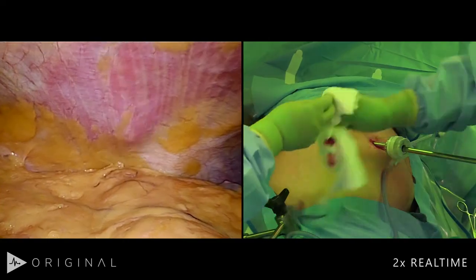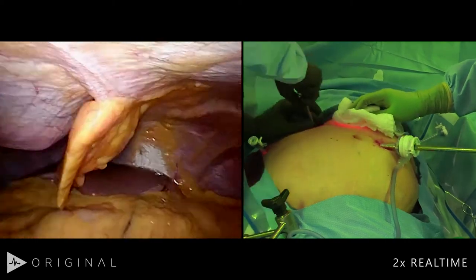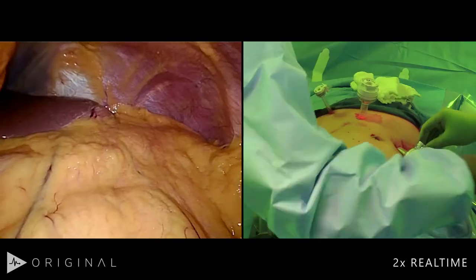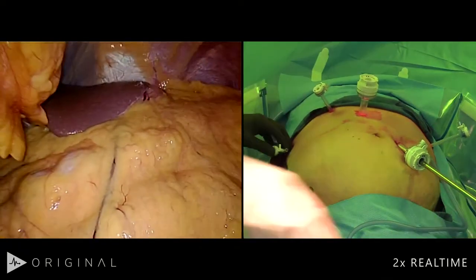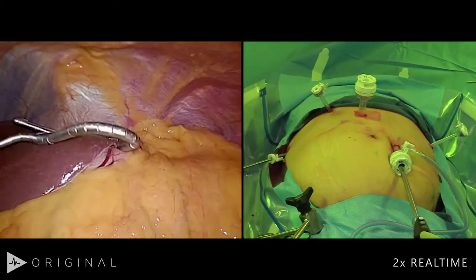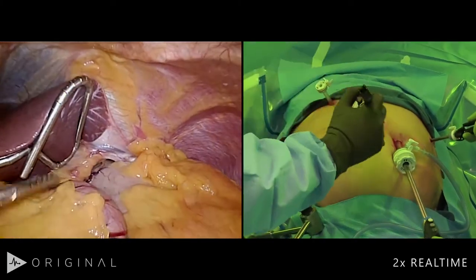We're starting the laparoscopic hiatal hernia repair. We normally place five abdominal trocars — three 5mm and two 12mm. The position of the trocars is relatively straightforward: two on the patient's left and three on the patient's right. The liver retractor is over here — this is a flexible tip liver retractor, and we're going to fixate it to the bed. We'll take a reverse Trendelenburg position. You can see right away this giant hernia.